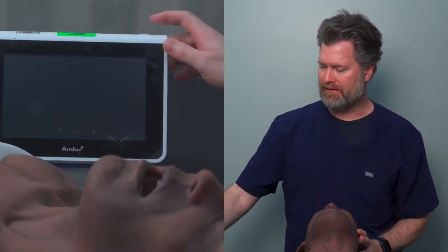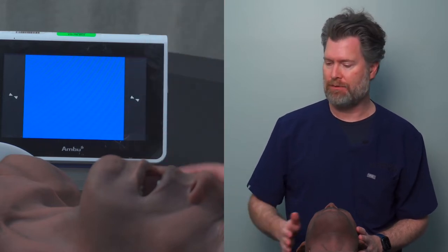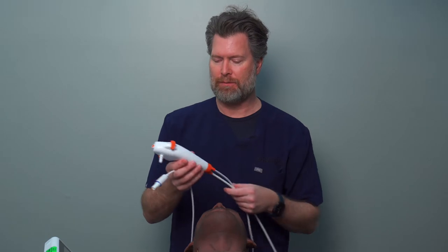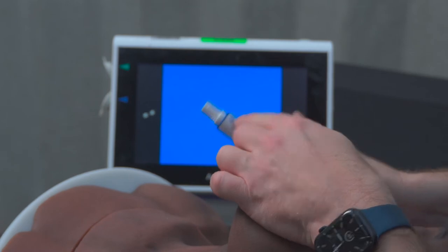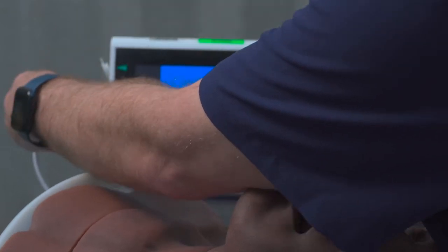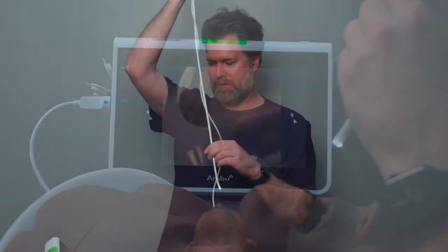Let's take a look at the Ambu A-Scope. The power button is on the top — it's simple, just press once and release. As soon as that happens, you should get this blue screen. Once you get the blue screen, you get the whirly twirlies, which just means nothing's plugged in yet. So you take one of these disposable fiber optic bronchoscopes. It has an adapter with a little blue triangle, and you can see a little blue triangle on the monitor, so they make it as easy as possible. Triangle to triangle, and you just plug it in — there you go. You've got the image on the screen.